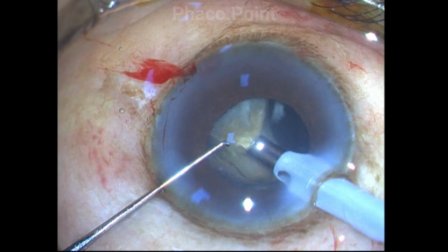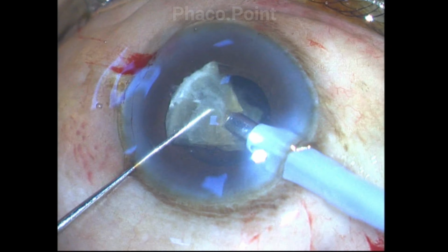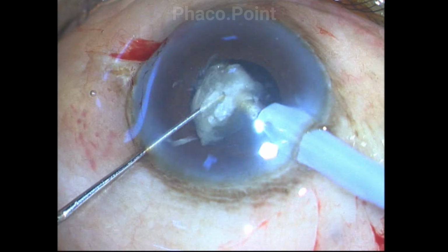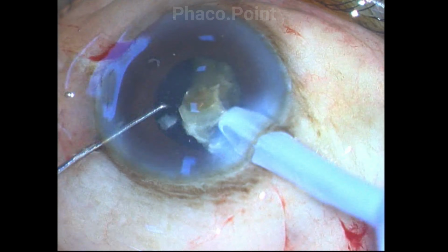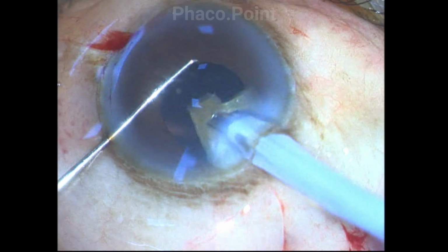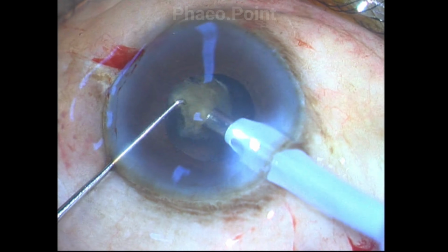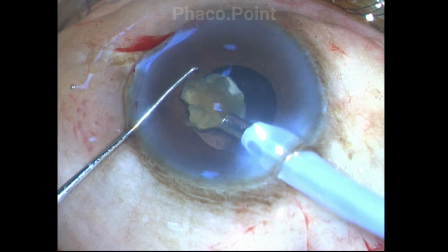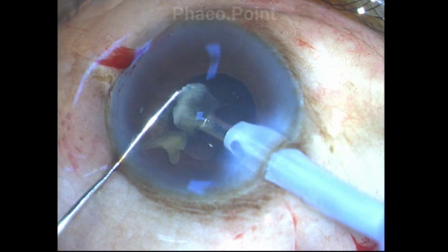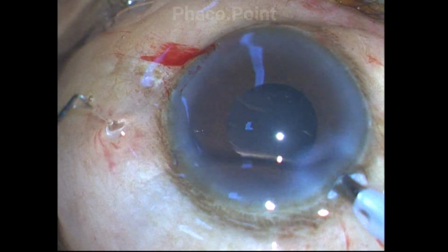This is the last fragment, brought up after burying into it in foot pedal 3, holding it in aspiration. It's brought up and subsequently emulsified. The second instrument always works as a guide that not only prevents the fragments from falling away, but nudges them into and towards the phaco probe. This has been quite clearly demonstrated here. This marks the end of the nuclear emulsification of this rather dense cataract.